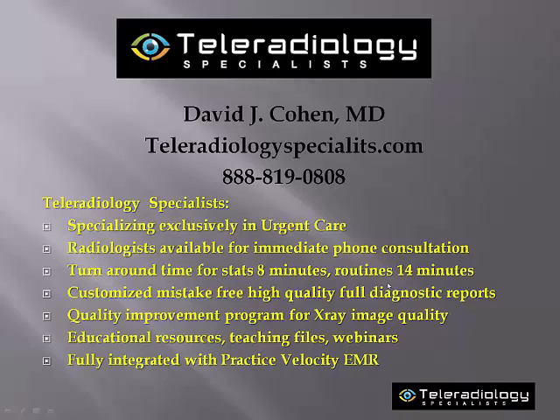We are pleased and excited to announce a recent partnership with Practice Velocity, by which we will be able to provide a fully integrated overread service with Practice Velocity, so that when you place your orders into Practice Velocity, we will be able to receive them automatically along with the images, and that when the reports are completed, they will automatically return to the Practice Velocity EMR.